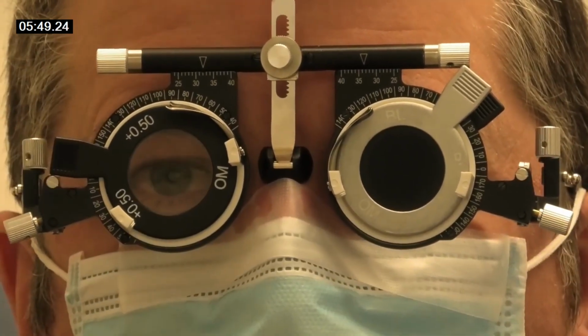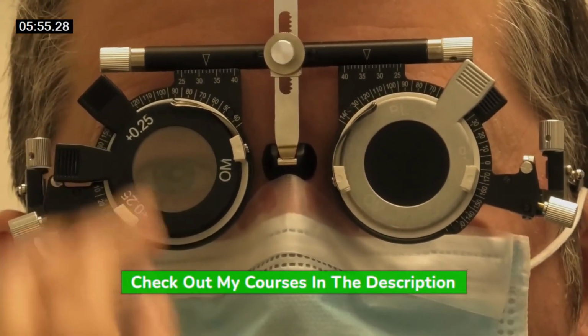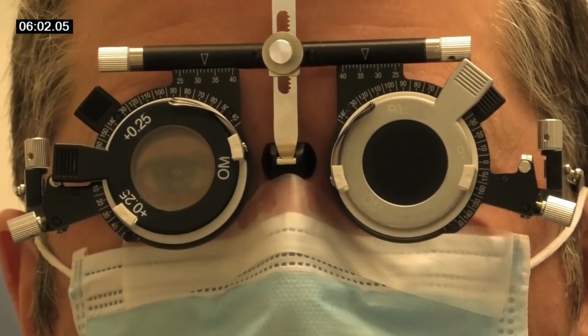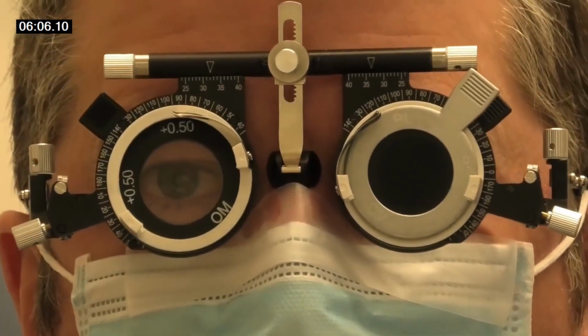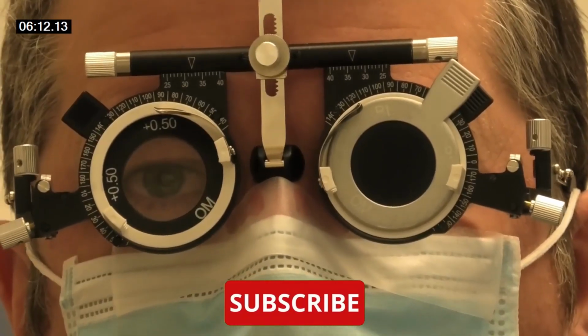And put that in front. So that's blurring it a bit more, and then take that one out, and that one, that's it. Put that on the back, that's it, and then you take that one out, and then you put that back in. So it's maintained. There we go, so that's blurring a bit like that.